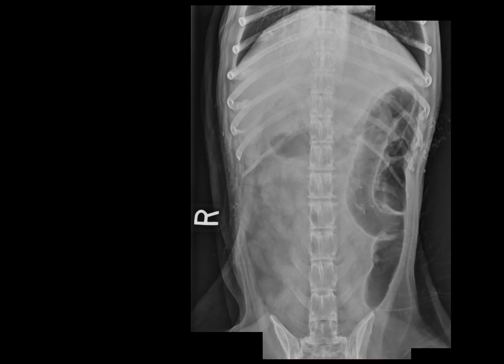On the ventrodorsal view, it's even weirder looking. Again, we have what could be two populations of small intestine by having distended and non-distended, but really all of the small intestine looks like it's in the right spot, and where I see the distended segments, it's all way off to the side, which is very unusual for small intestine, making me think it's large intestine.